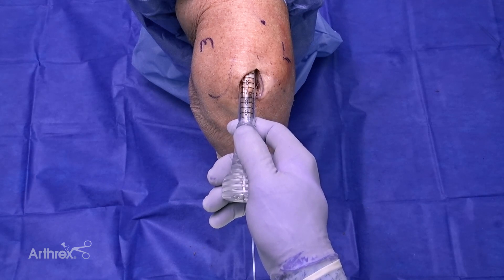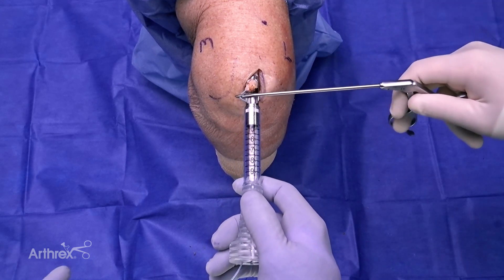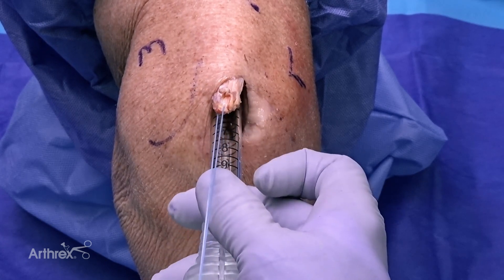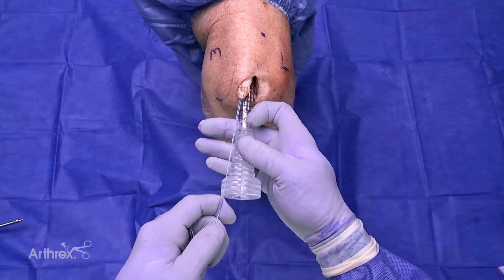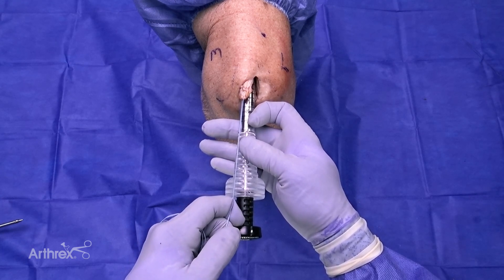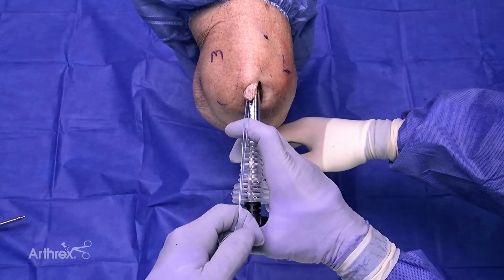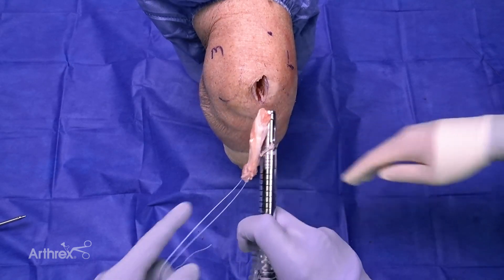After reaching my desired graft length, I back the harvesting tube to visualize the window and retrieve the traction sutures. I then deliver the graft through the harvesting window and lay it on top of the tube. Since there are no sharp edges, I am not worried about cutting the graft prematurely. With the push rod inserted to facilitate final amputation, there are two important checks: ensure adequate tension on the traction suture, and confirm the graft length on top still matches the desired length. Keeping tension on the traction sutures and using a motion like injecting a syringe, amputate the graft. Graft harvest is complete.